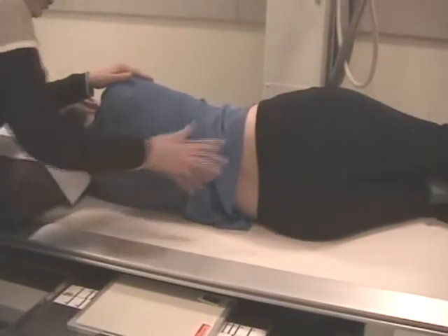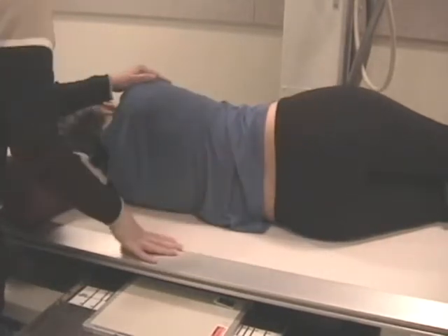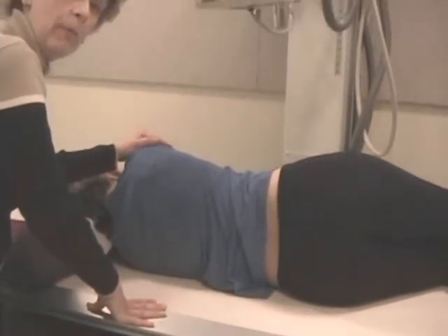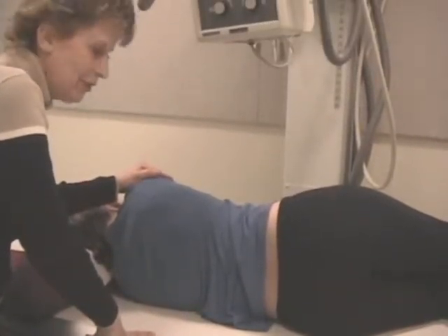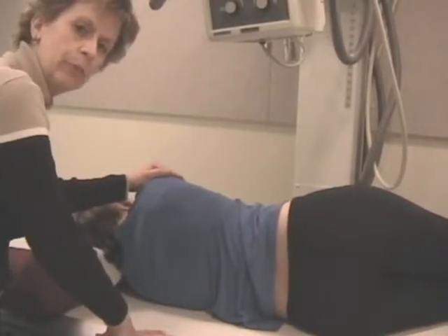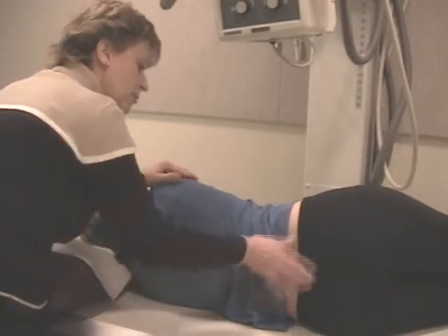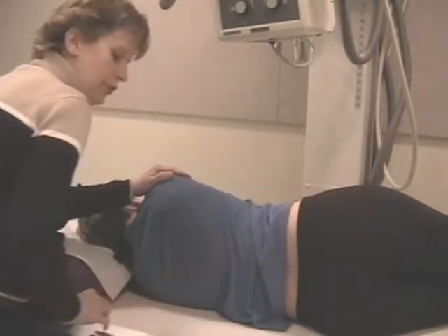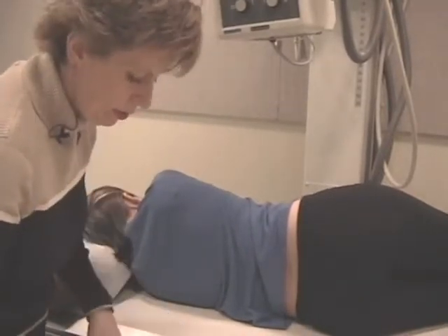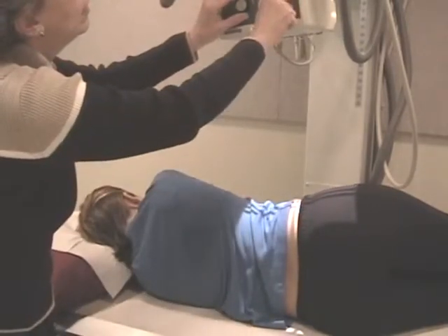I moved my patient. When you're actually in the field, after you make your exposure on your lateral, just tell your patient they may breathe, but do not move, and then you don't have to straighten them back out. But when I was demonstrating the sponge, I actually changed her relationship a little bit. So I'm just double checking that her shoulder blades and the small of her back are nice and lateral and that she's straight. I have an 8 by 10 in the cassette holder, left marker. I need to collimate.